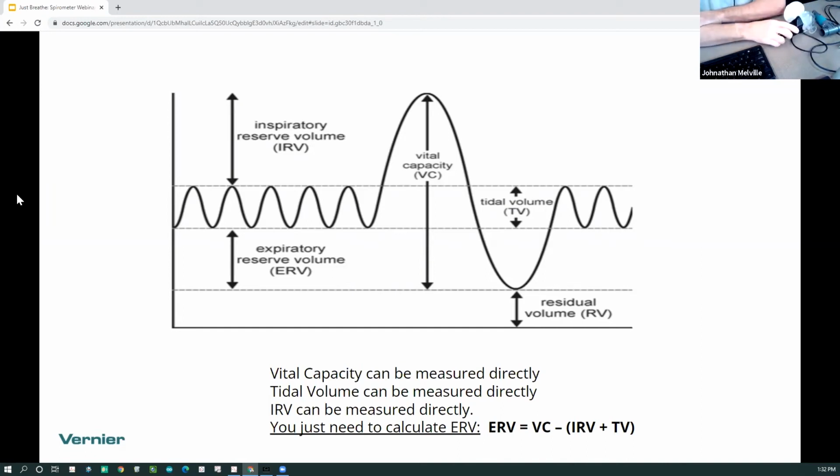And these are differential flow sensors that are in these. So they're really, really sensitive to changes in position. And that's why you'll see data that floats up or floats down. So it's really important that you zero and then breathe in the proper position.